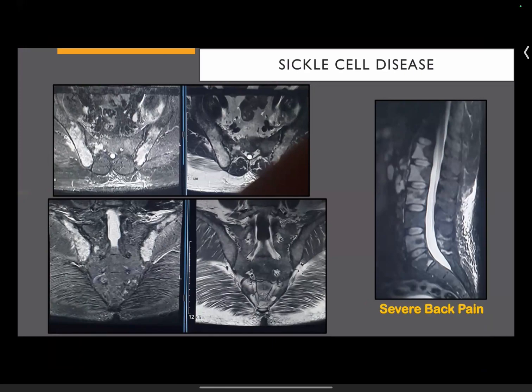The key thing is you have to have a good quality plain T1-weighted image if you're dealing with tumor or infection, to give the surgeon an idea where the tumor ends to plan the resection margin. And I agree, when there's edema, it's tricky. If you're talking about malignant tumors like Ewing's or osteosarcoma, and there is edema in the marrow that enhances, you can't tell whether there's any micro spread distal to the lesion. So it has to be taken into consideration when resecting the tumor. But most of the time these tumors get neoadjuvant chemoradiotherapy, and you can hope that the tumor regresses, though again, it's case to case.